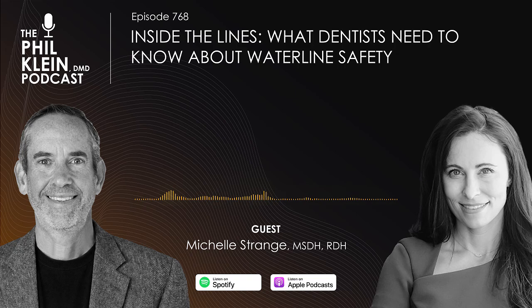Okay. So getting back to what you said, Michelle, about testing and then shocking directly afterwards and not waiting. So you're going to test, you're going to shock right away. Then you're going to get your test results back. And most of the time, if not all of the time, you're going to pass. But that crazy time where it comes back failure, you need to remediate. And since you already shocked, what do you do next as far as what we're calling remediation?